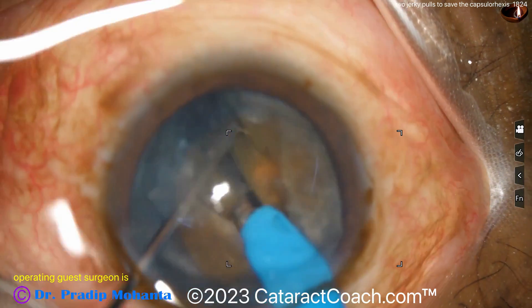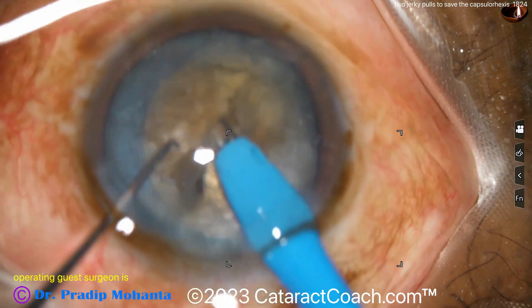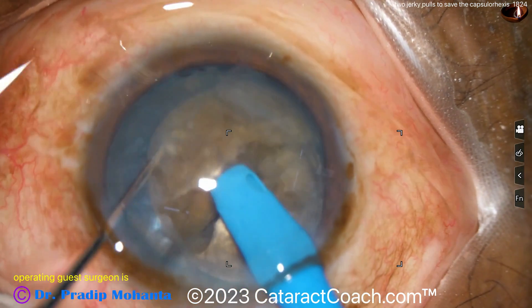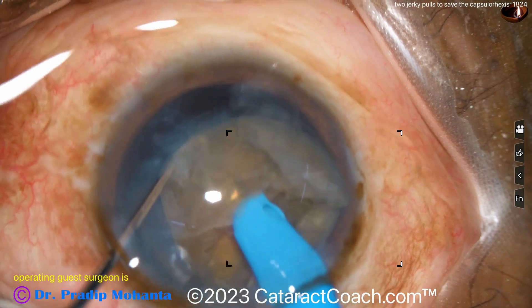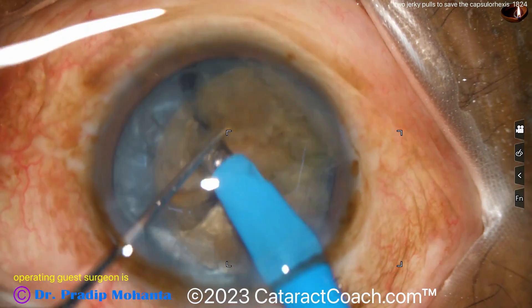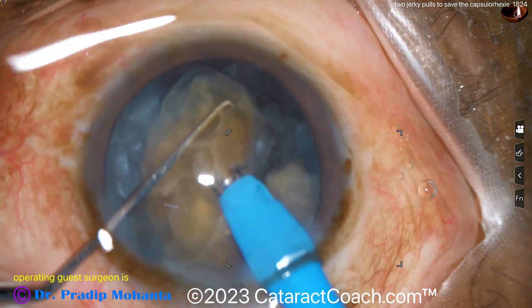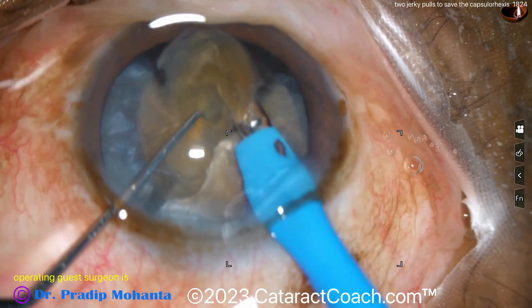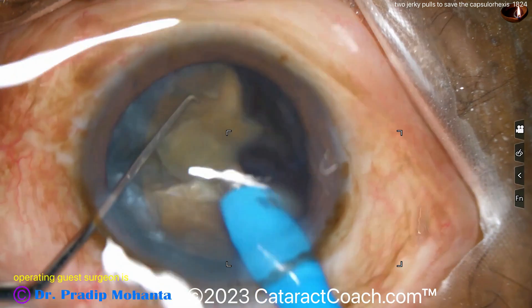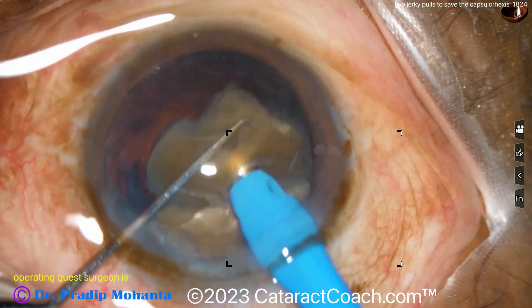Split it more — almost there. Now you'll get two full halves. Fully separate it, then get the first half and separate it into smaller quadrants. Spend the time to make sure it splits — if the chop didn't propagate, go through until it fully does. Now tilting the nuclear quadrant to get that apex — the densest part — first, and then the rest comes down pretty easily. Remember the end of the nucleus, the center, that apex of the quadrant, is the densest and now it can be chopped.